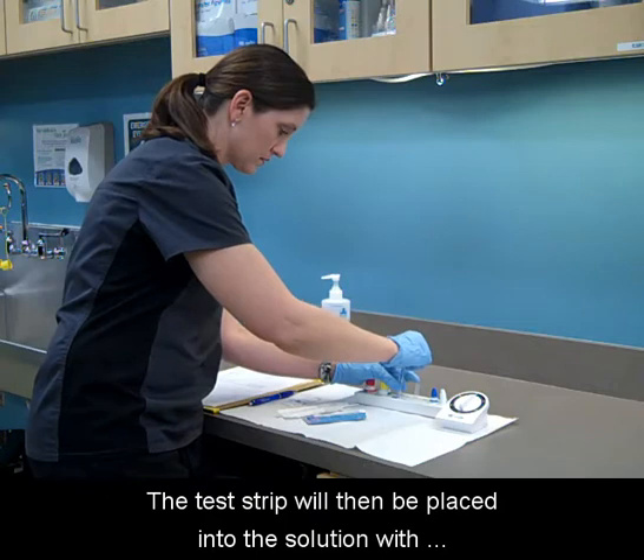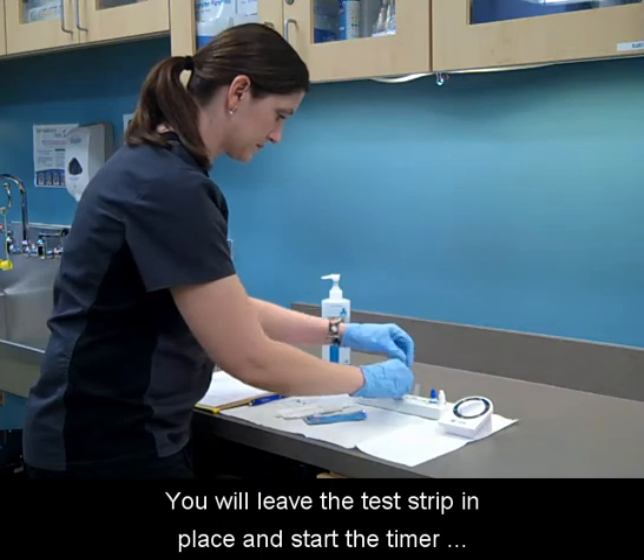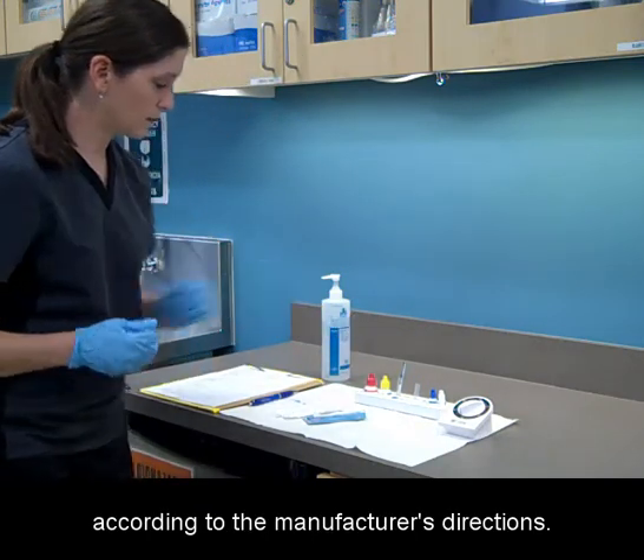The test strip will then be placed into the solution with the arrows pointing down. You will leave the test strip in place and start the timer according to the manufacturer's directions.